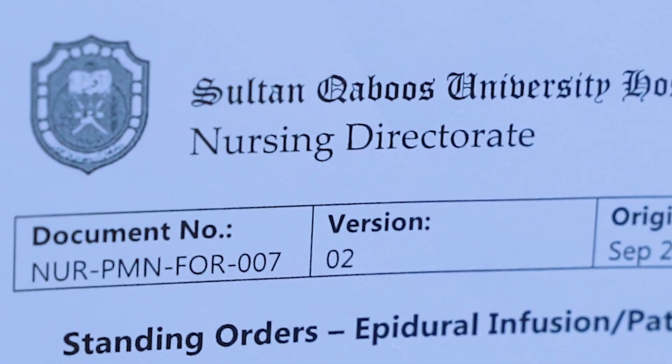Clean around the catheter exit site using a skin cleansing agent — normal saline or 2% chlorhexidine — and allow it to dry well. Apply an occlusive dressing and leave it in situ for 24 hours. Discard items used as per waste disposal policy. Perform hand hygiene after the procedure. Document the procedure in the EPR. Continue to assess the patient for any motor weakness or deterioration, and monitor the epidural catheter site for 12 hours. If any of these are present, notify the pain management team and anesthetist on call.